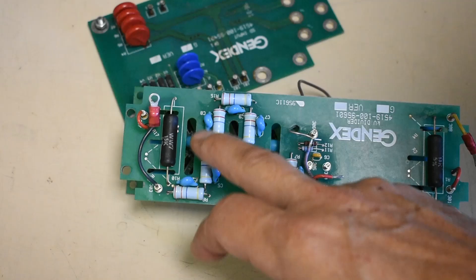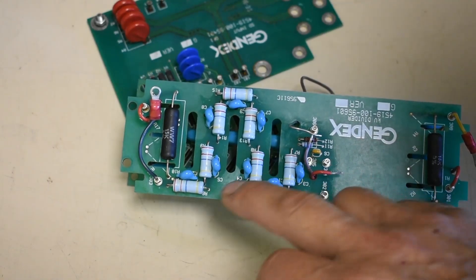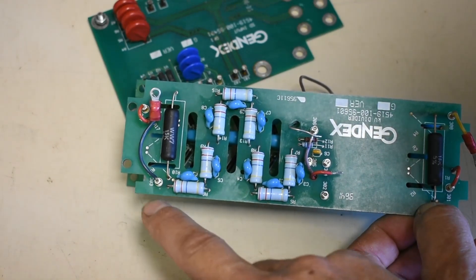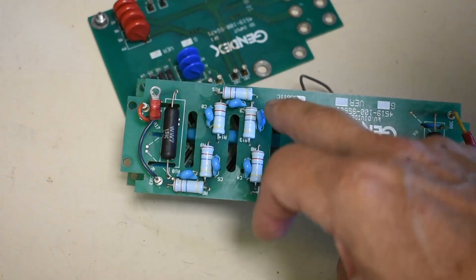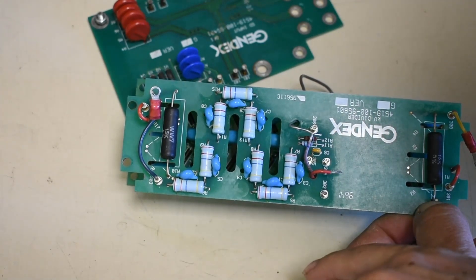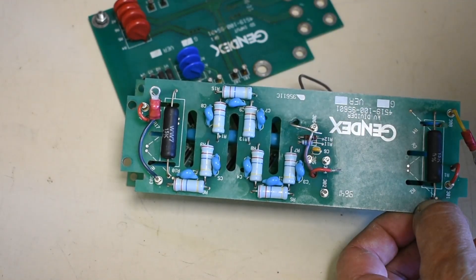One other point, this is the high voltage potential divider for the high voltage pin here. So you notice the gaps for basically for insulation and so on. But it's all discrete components.